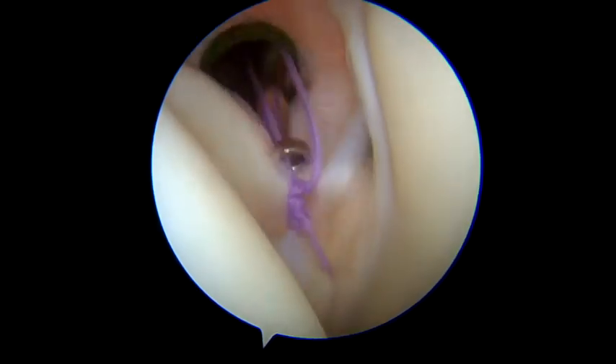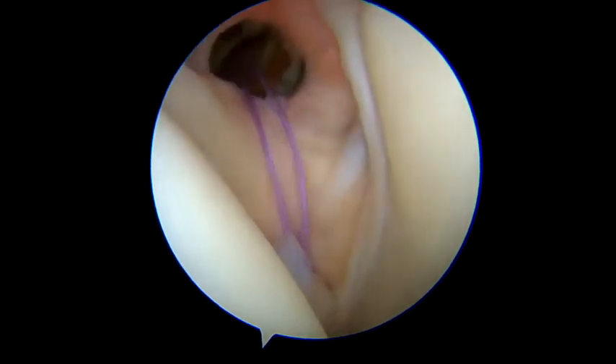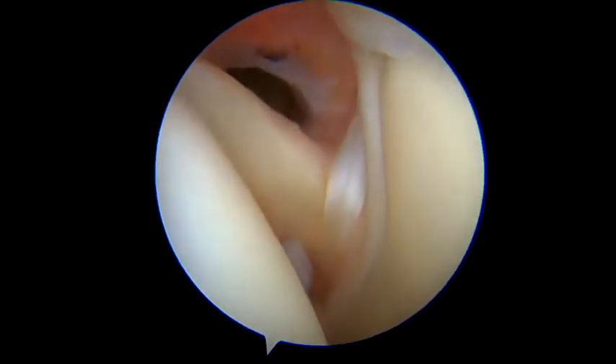At this stage, and more specifically for patients without a clear multidirectional instability, the persistent drive-through sign can be assessed intraoperatively, potentially reconsidering the indication for a posterior capsular plication.